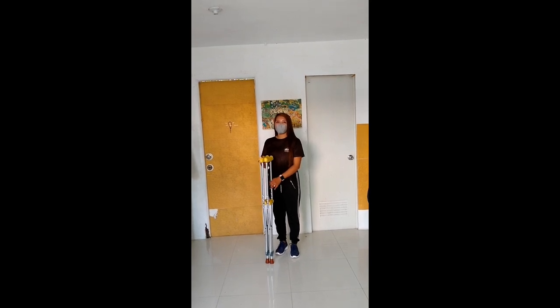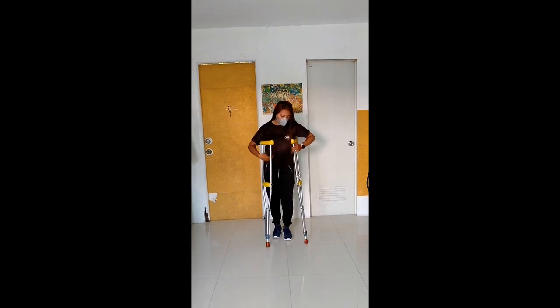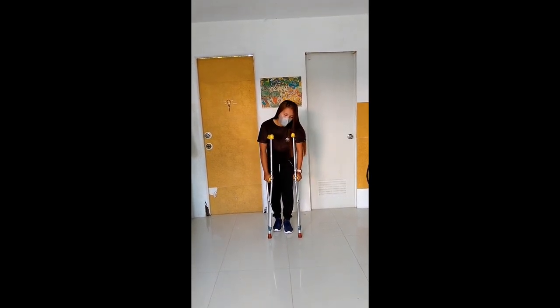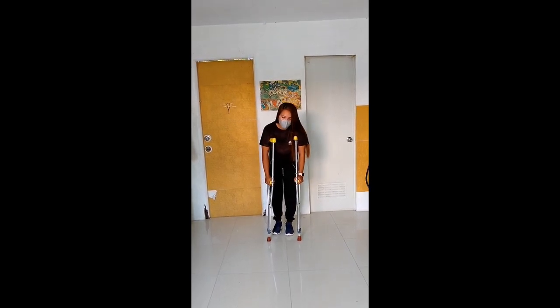Ang susunod nating ways ay swing-to. Sasabay niyo lang yung una niyo lang, forward yung dalawa yung crutches. Pati, sasabay niyo ng dalawa yung pa.